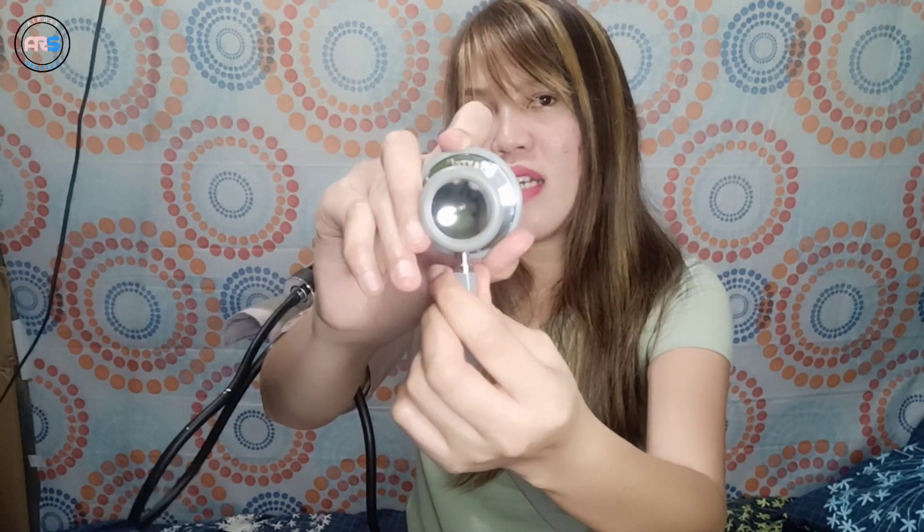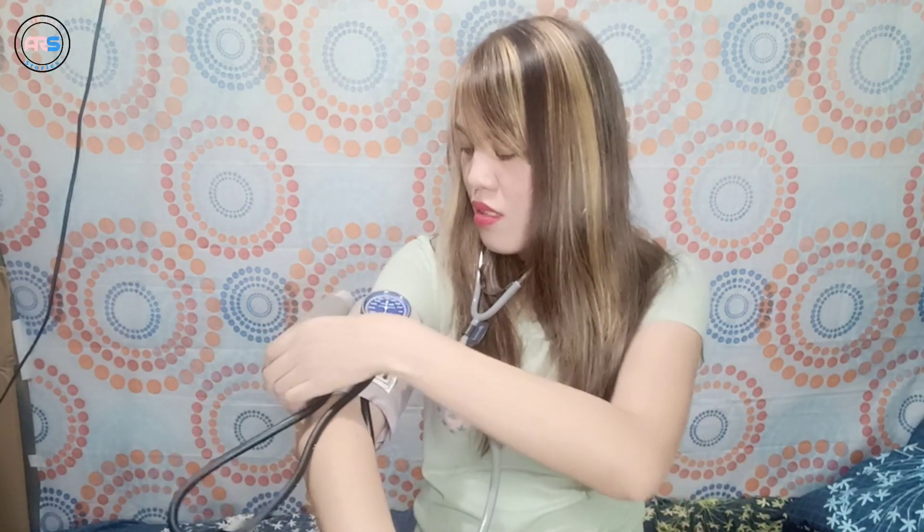So, syempre kung ilalagay natin ito sa ear natin, it should be facing the correct direction. Para marinig natin yung pulse ng ating brachial, we have to open this part — just push and turn it open. May makikita kang silver — pag silver na yung makikita niyo, ibig sabihin open na siya. Kung i-close mo siya, ikot mo lang ulit. So, close po yan.